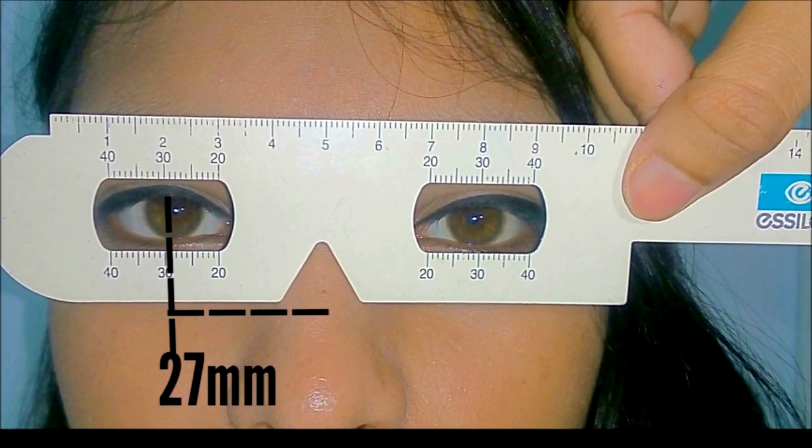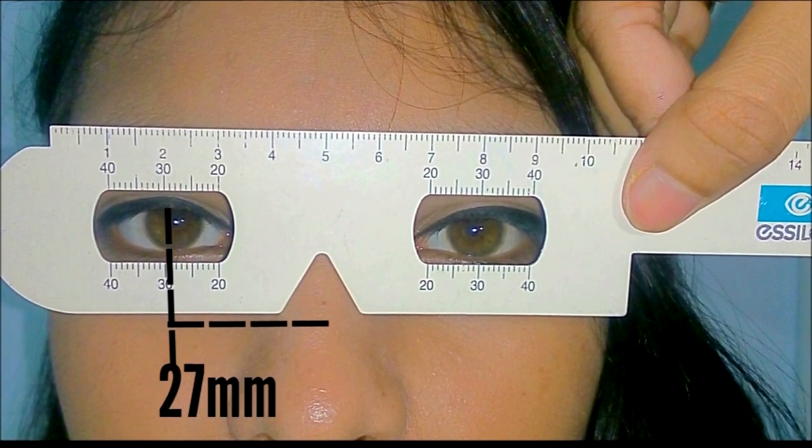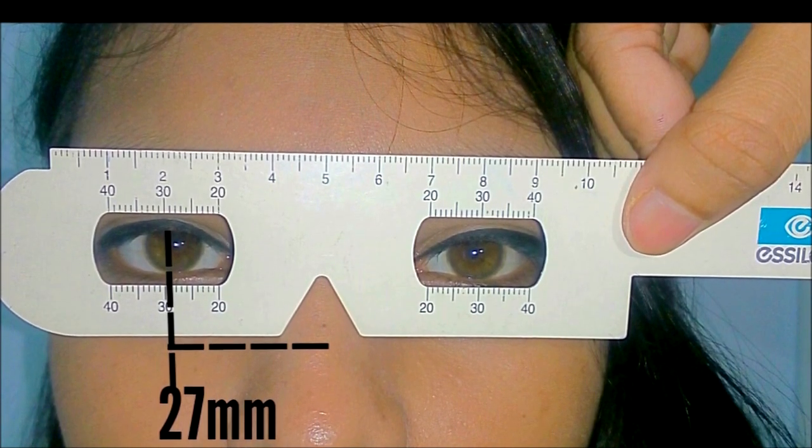The examiner closes their right eye and looks directly into the patient's right eye. Make sure the patient looks directly into the examiner's open eye while being measured. Make a mental note of the measurement from the center of the bridge of the nose to the center of the pupil in millimeters.